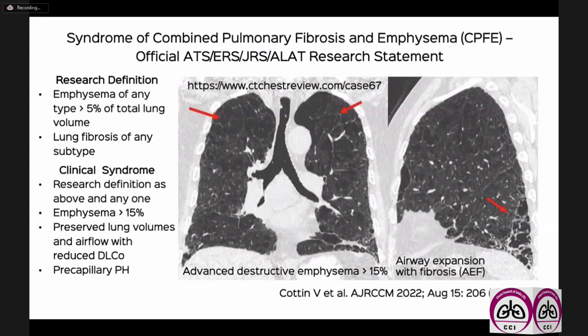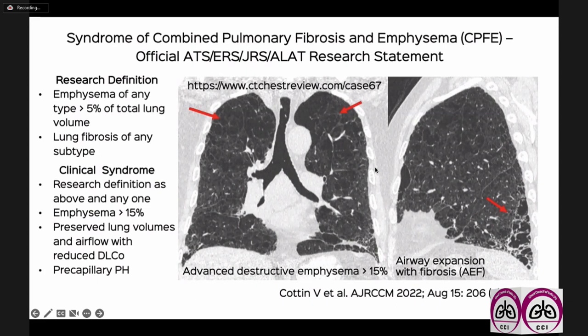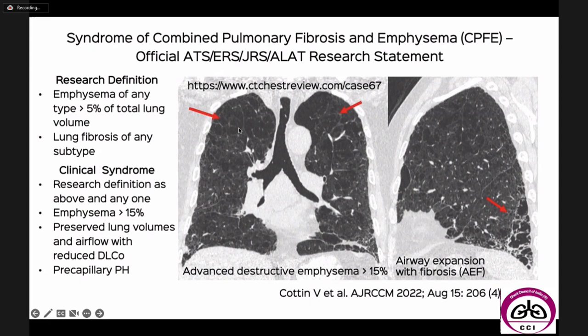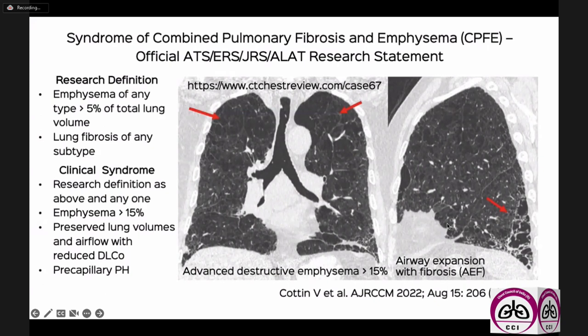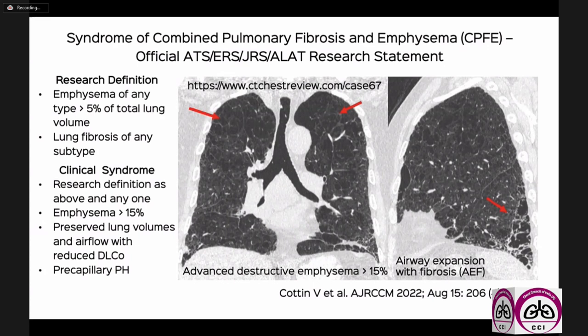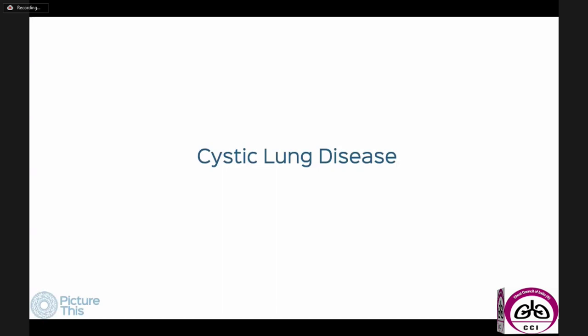Sometimes the etiology is unknown, but if we've seen progression on two scans, that is sufficient evidence to start antifibrotics — which is the rationale for defining PPF. The other entity better defined in 2022 is combined pulmonary fibrosis and emphysema, occurring mostly in smokers but also in non-smokers: upper lobe confluent and advanced destructive emphysema with a UIP-like fibrosis below. This unique condition, CPFE, behaves differently clinically and may have a different prognosis.